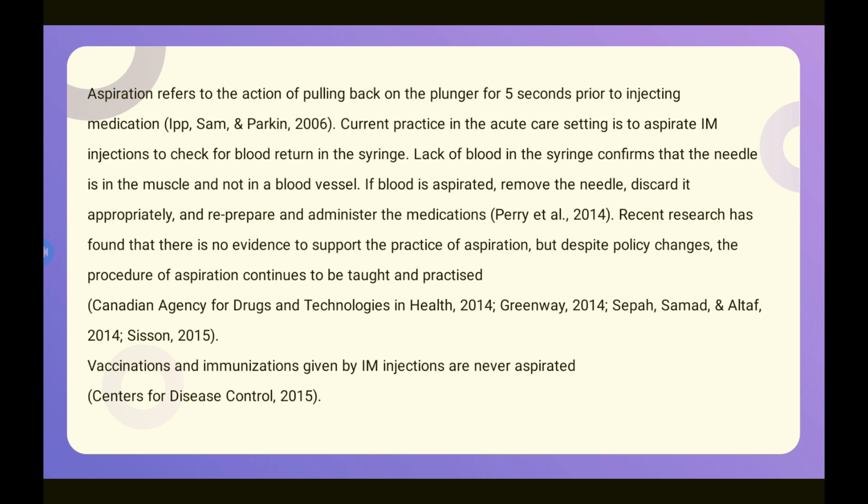Recent research has found that there is no evidence to support the practice of aspiration, but despite policy changes, the procedure of aspiration continues to be taught and practiced. For vaccination and immunization given by intramuscular injection, never aspirate.